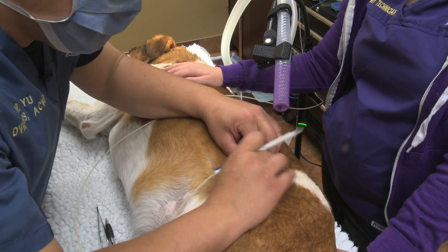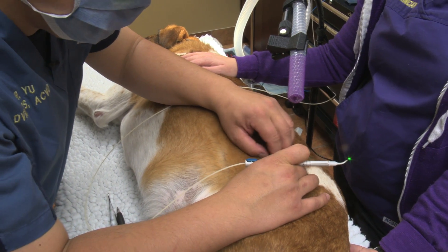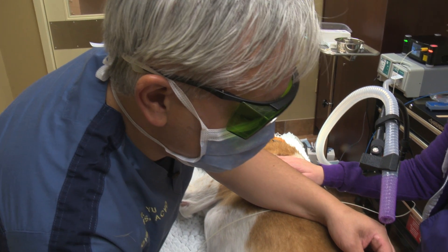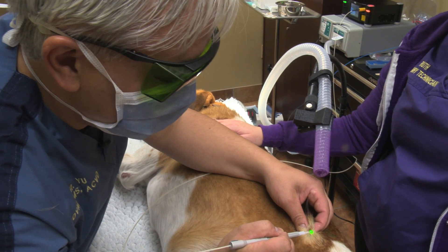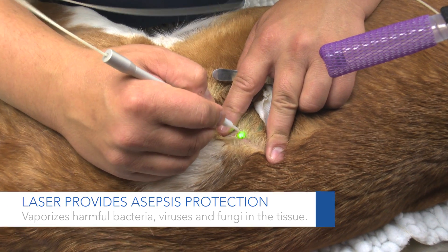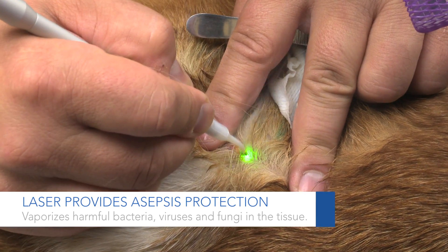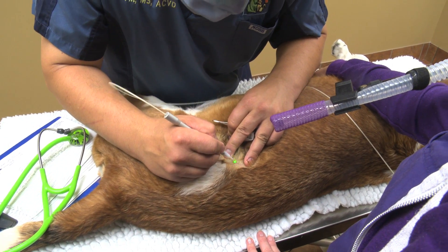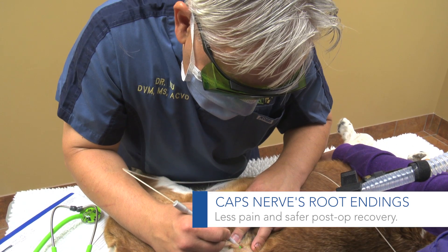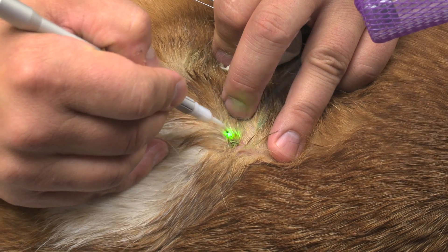Some of you may be wondering why I'm not wearing gloves. I want to be able to feel the masses and feel the tissue, and sometimes that gets very difficult with gloves. These are not aseptic procedures, and the laser actually provides asepsis by vaporizing all the bacteria, fungal particles, and viral particles within the tissue. Post-surgically, it's capping off nerve root endings, so the pets don't feel any itch sensation or pain post-operatively associated with these sites.